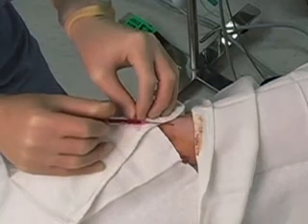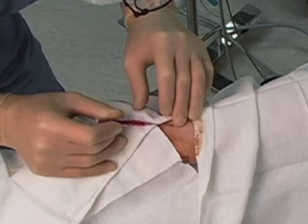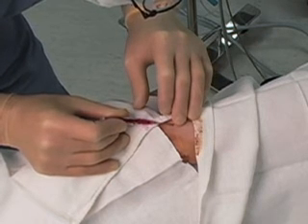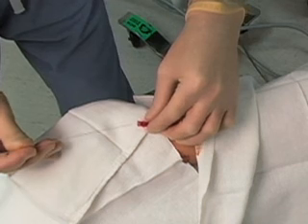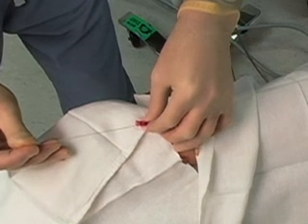There are some common problems that can occur during arterial line placement. If, in the over-the-needle technique, no blood return is obtained after the initial flash, the catheter can be advanced through the vessel and the over-the-wire technique can be employed.